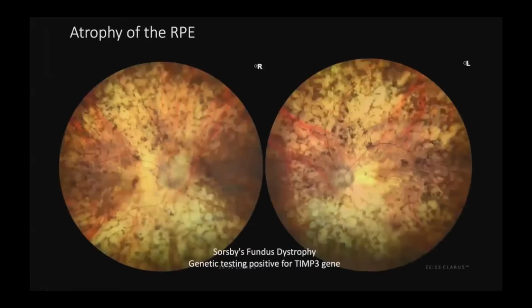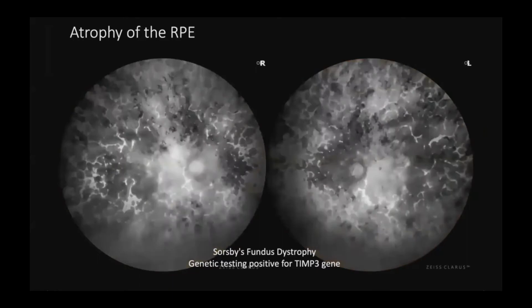And so autofluorescence can be used as a surrogate for health of the RPE. And so we'll see hypoautofluorescence with severe RPE atrophy. And so this is a case of Sorsby's fundus dystrophy confirmed by genetic testing positive for TIMP3. And here we can see the autofluorescence really shows us the areas of RPE loss. And this can be helpful to follow progression over time.